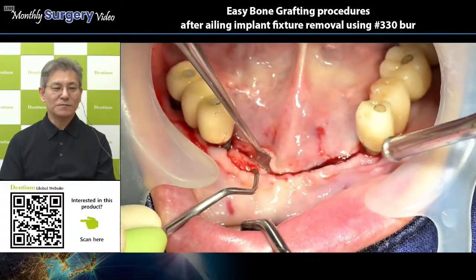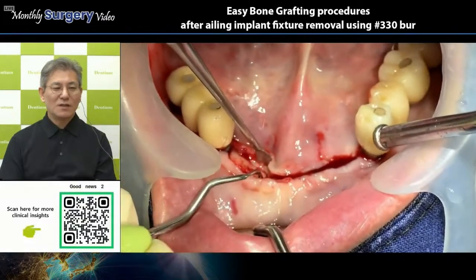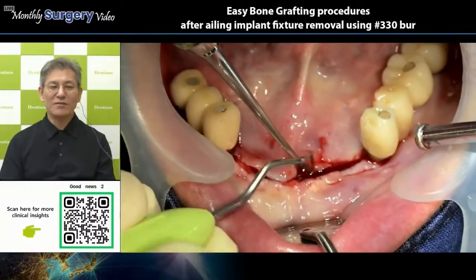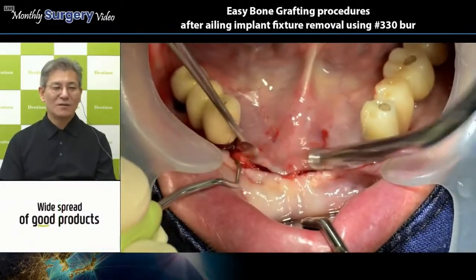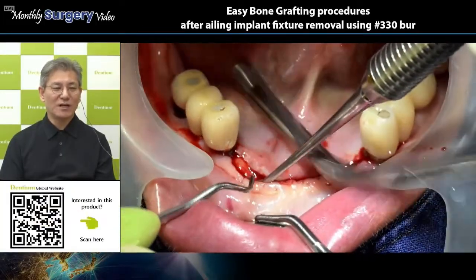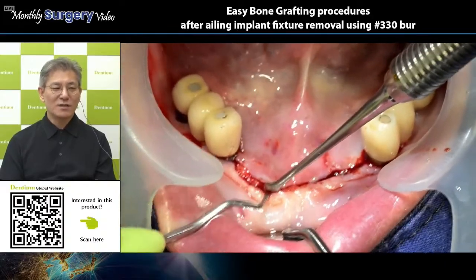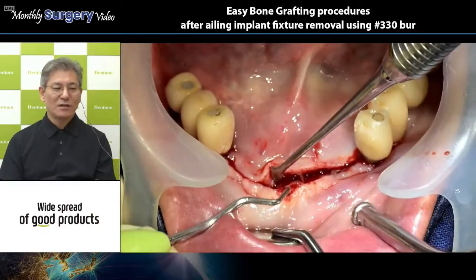With a cover screw. The lower anterior mandibular area gave us a lot of history about the treatment and procedure. Why? They already installed implants in the 33 area, and on the opposite side there is an edentulous, thin, narrow ridge.